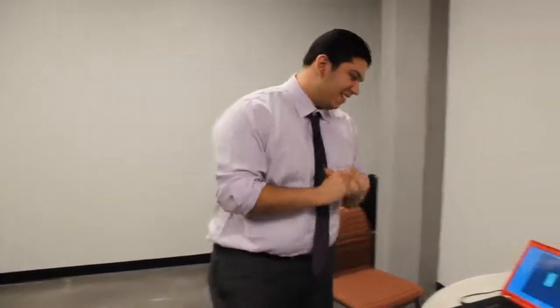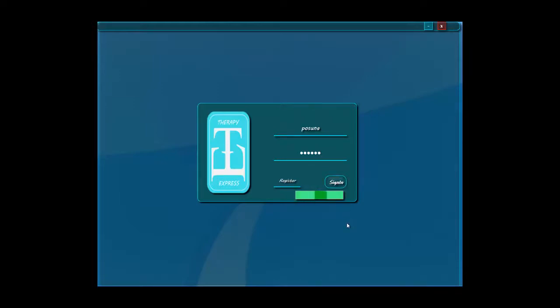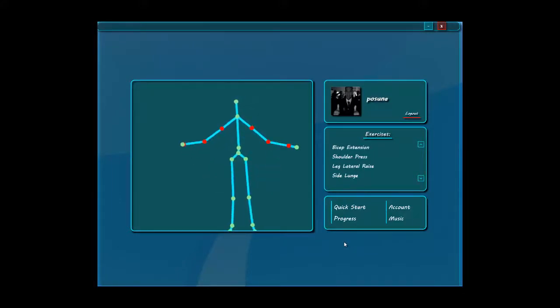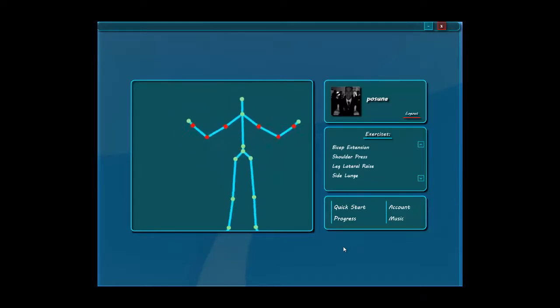Great. Take us to the app. So now we're going to go ahead and pretend I'm a patient logging in from home. As you can see, as soon as we log in, we see a rendering of the model of the whole entire body of the patient. And it tracks their movements as he moves.